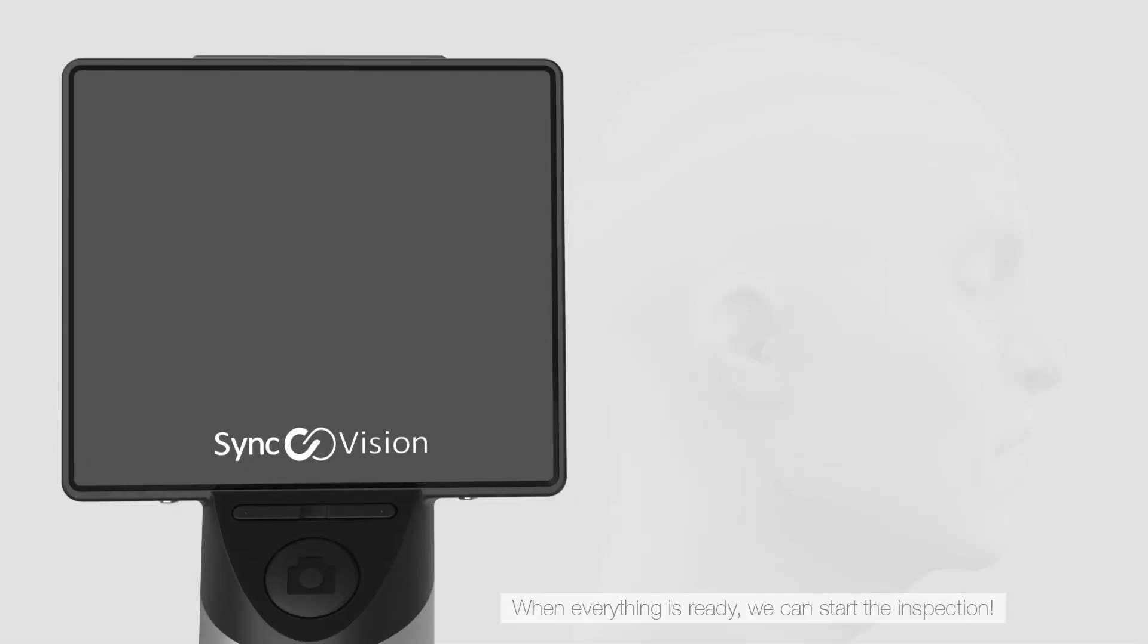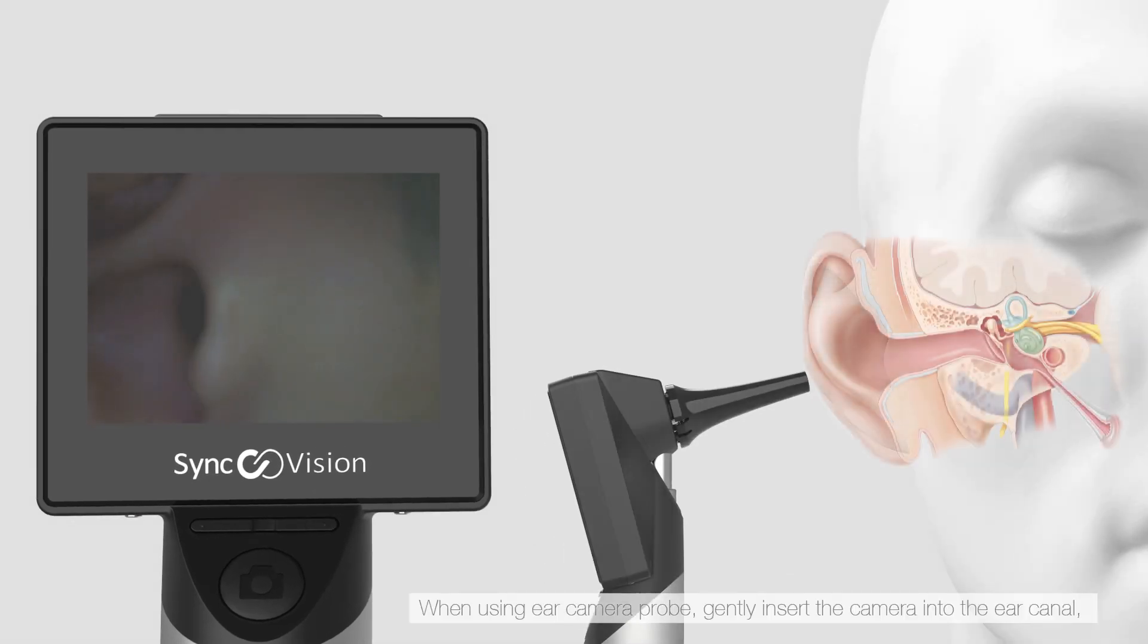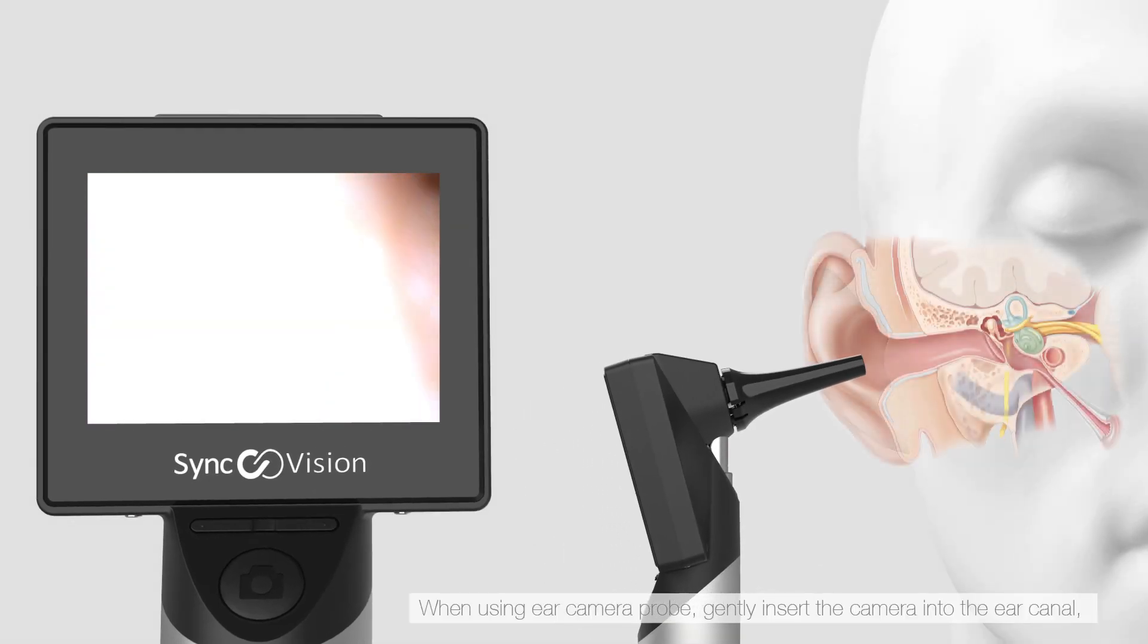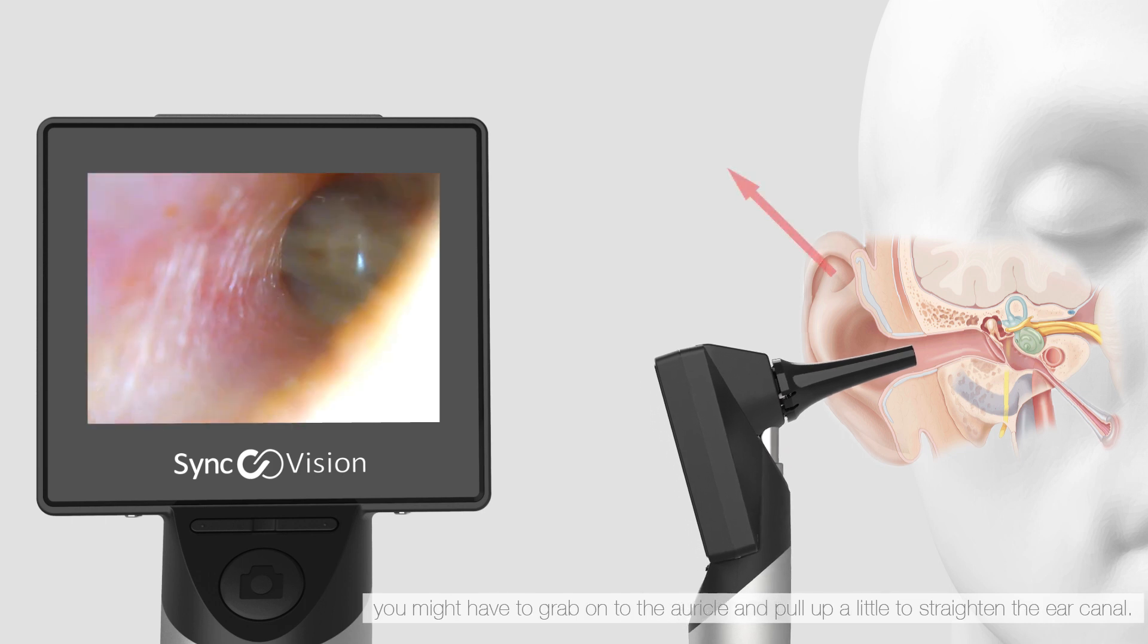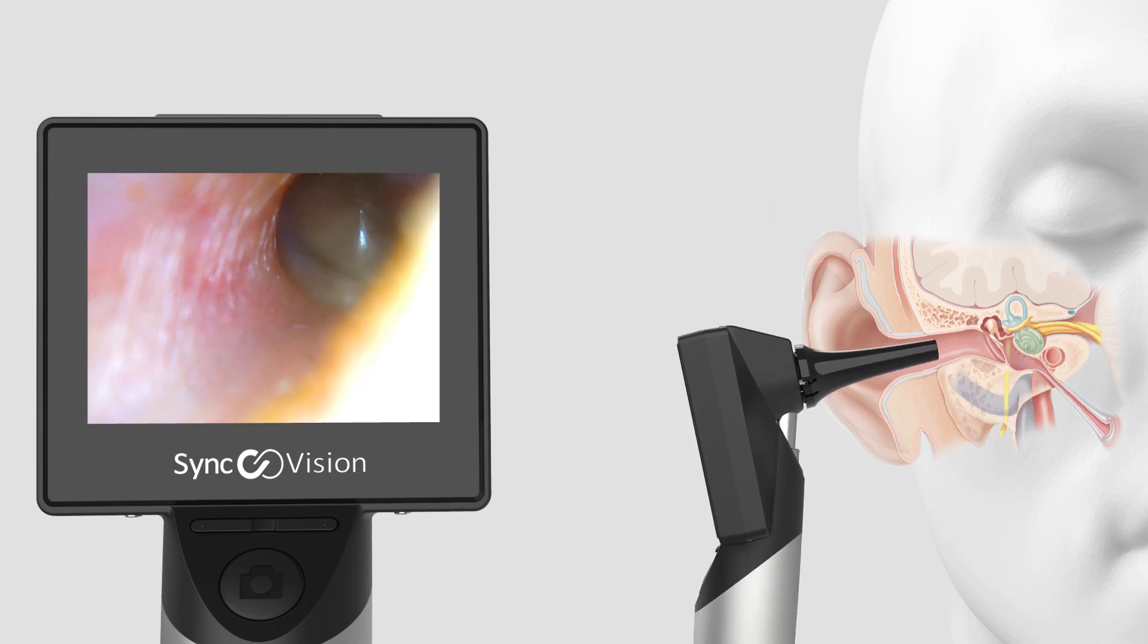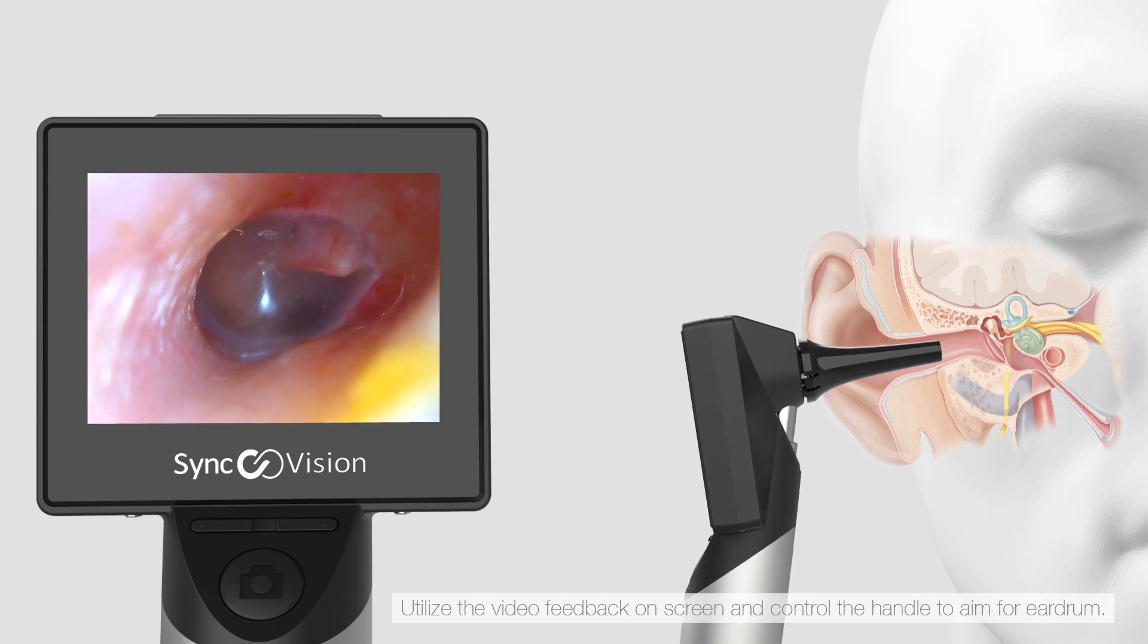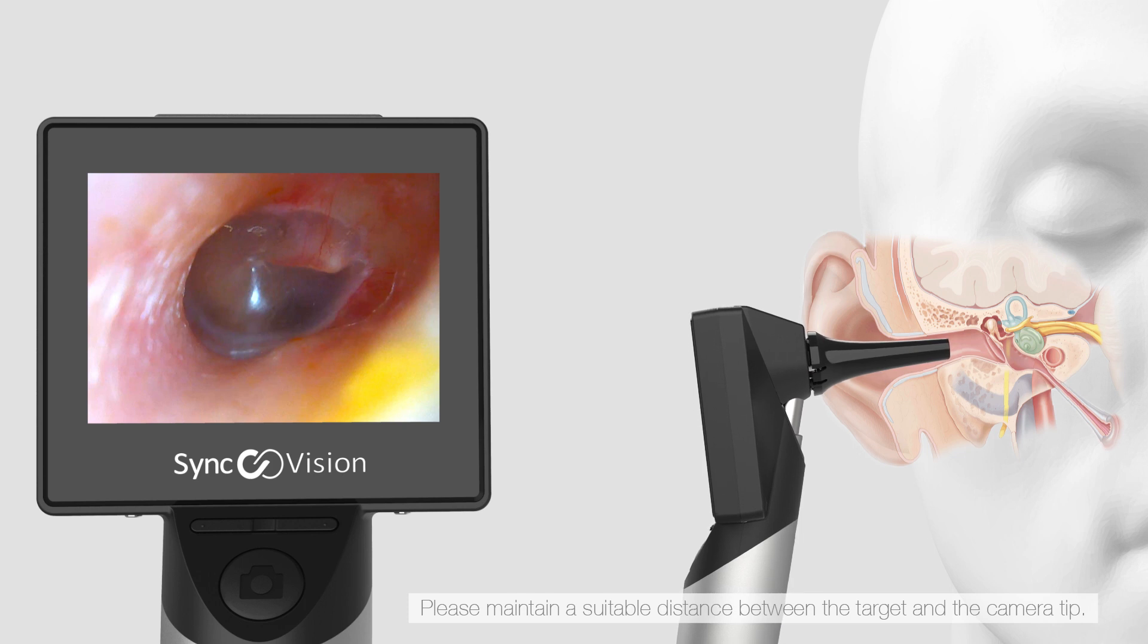When everything is ready, we can start the inspection. When using ear camera probe, gently insert the camera into the ear canal. You might have to grab onto the auricle and pull up a little to straighten the ear canal. Utilize the video feedback on screen and control the handle to aim for eardrum. Please maintain a suitable distance between the target and the camera tip.